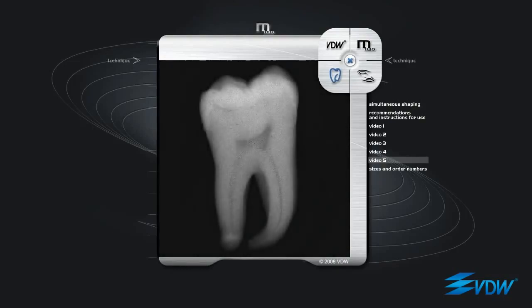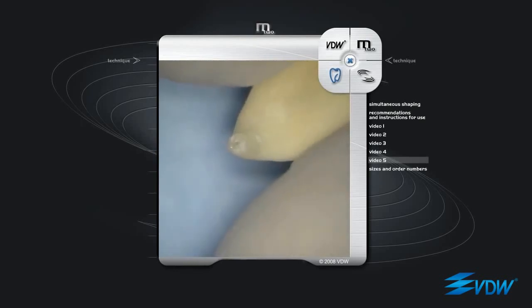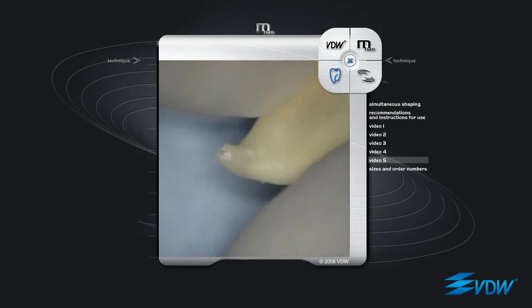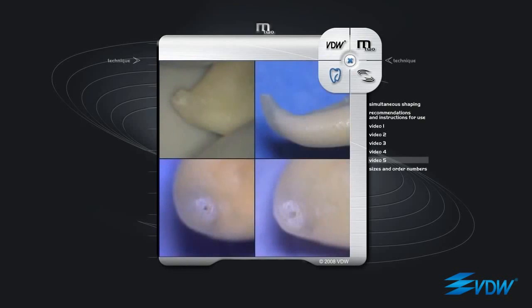A lower molar mesial root canal with a strong curve in the apical third has been selected. The root canal is prepared with M2 instruments using the simultaneous shaping technique. Once it has reached the apex, the last instrument, ISO 25 taper 06, the largest and least flexible instrument in the basic sequence, is used at full working length for approximately one minute, moving it back and forth, keeping the instrument tip at the apex or just beyond. This has been done to demonstrate the effect of instrument use in respect of apical morphology. The result is significant: absolute respect of the apex and very precise round preparation.